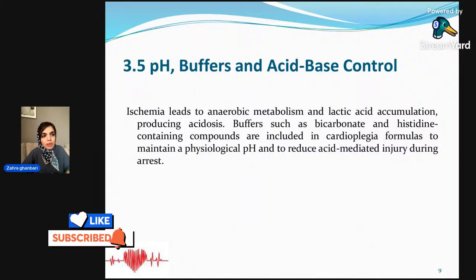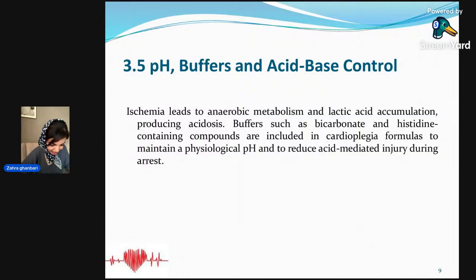And for some patients that have a high ICP, the pressure of their brain is high, it's very dangerous to use pH stat because we vasodilate the vessels of the brain, and by this the circulation of the brain increases and helps ICP become higher. So it's so dangerous.